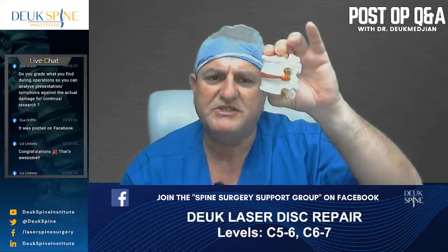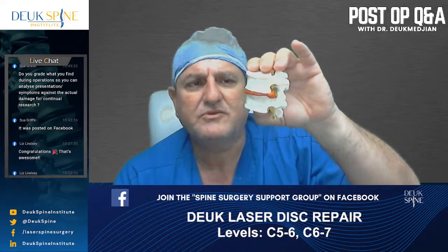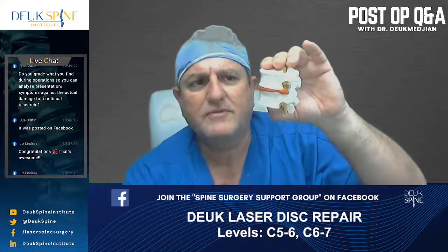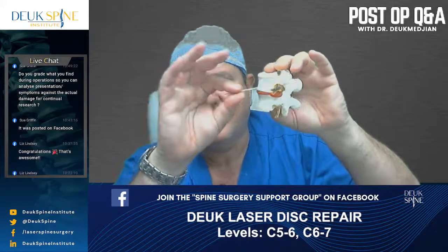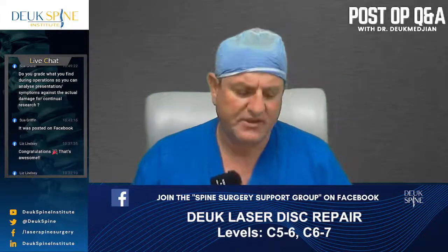I made my own changes, made it better. And it's better because it has better results than their surgeries. And we're able to actually cure neck pain and headaches that come from the herniation, as well as the arm symptoms. So that's what we did. We went through the disc, left the rest of the disc alone, got to the back, and I just zapped out the herniation, and I debrided the annular tear.